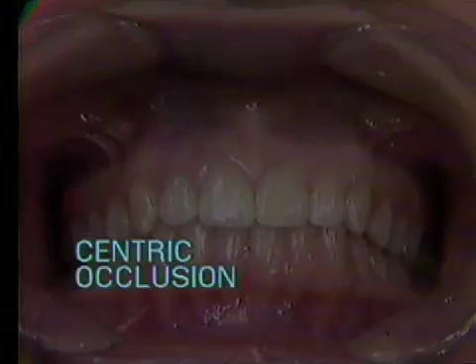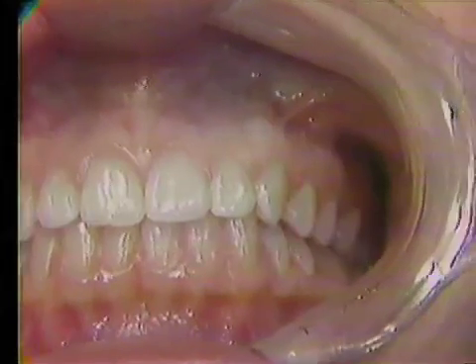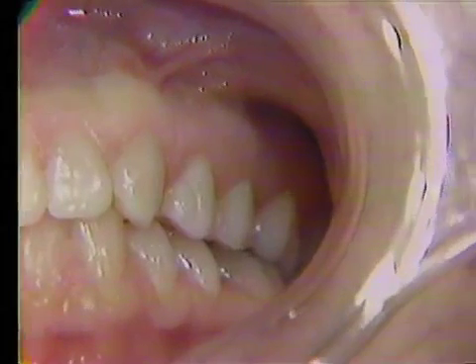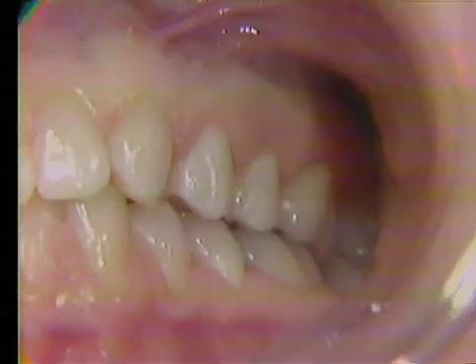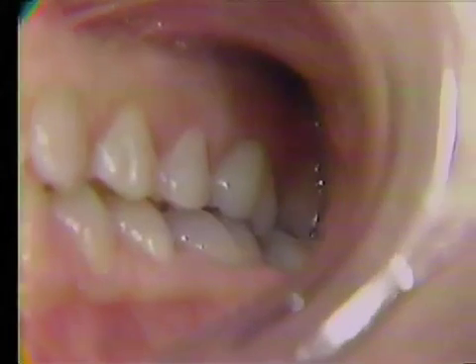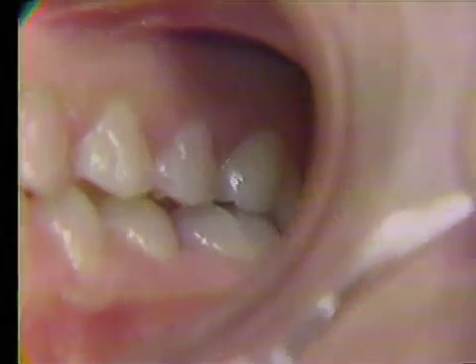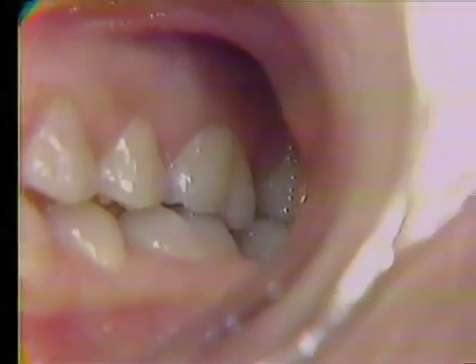The teeth are in centric occlusion when there are maximum contacts between all the opposing teeth. The contacting areas on all the teeth should be studied. This can be done on the articulated cast, but time does not permit for such a thorough examination of the patient on this TV tape. The centric occlusion contacts on the three teeth that will be used for the diagnostic waxing exercise and their antagonist will be checked.